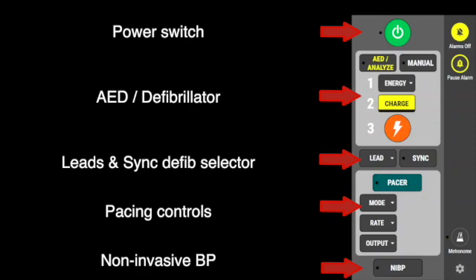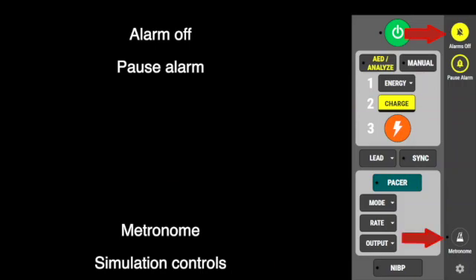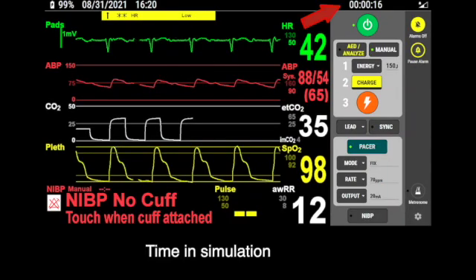Additional controls include non-invasive blood pressure, alarms off, pause alarm, metronome, and simulation controls, as well as time in simulation.